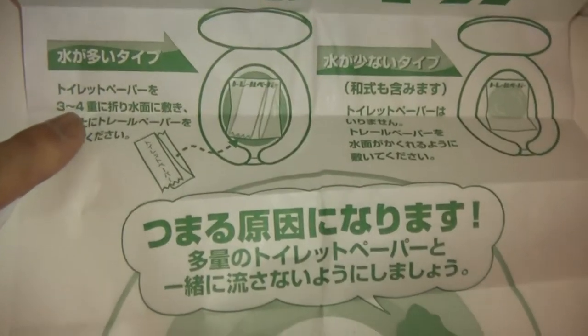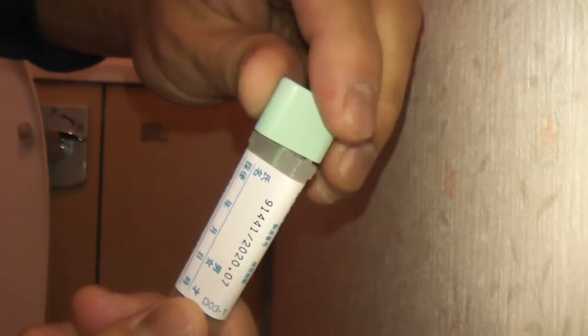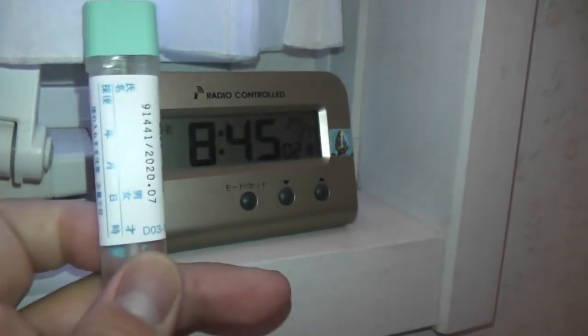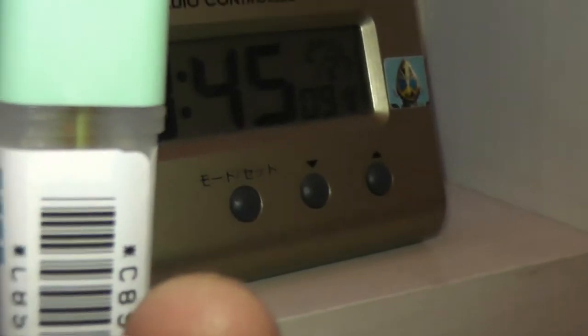It is time for experiment number one. First I need some layers of toilet paper — three to four layers. I'm going to place these layers inside the toilet, then take the paper with the green star on it and place it on top. I am now sitting on my toilet seat and I'm going to twist off this cap. I have taken my sample and it's in the vial. The time is 8:45. My sample is slowly going down into the vial.